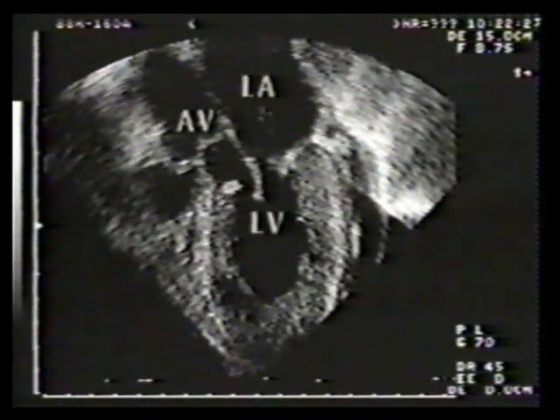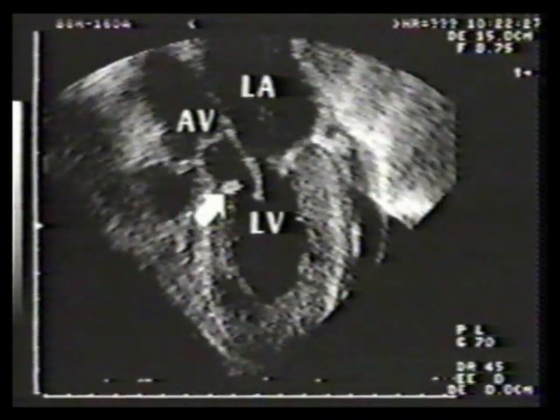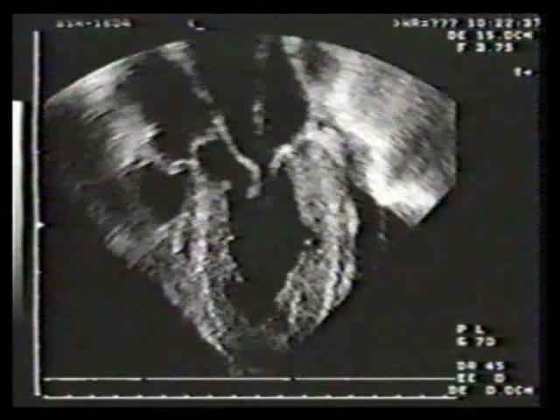This is an apex-down, long-axis view of the left ventricular outflow tract in the same patient. Notice the hyperrefractile pedunculated mass in the left ventricular outflow tract. This small undulating tumor is very characteristic of the fibroelastoma or papilloma and is a benign tumor, rarely exceeding 1 centimeter in diameter.